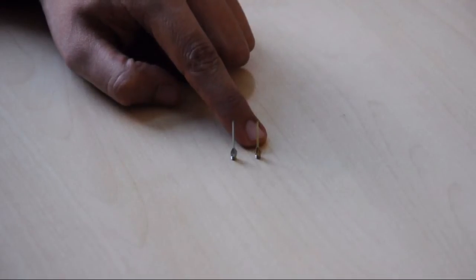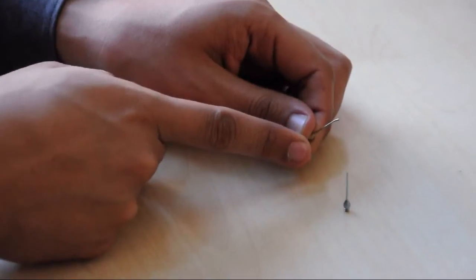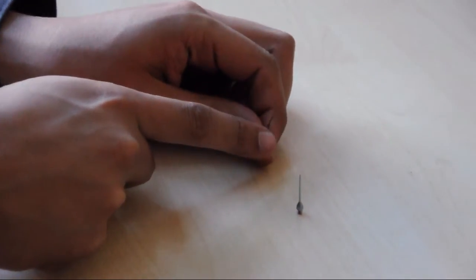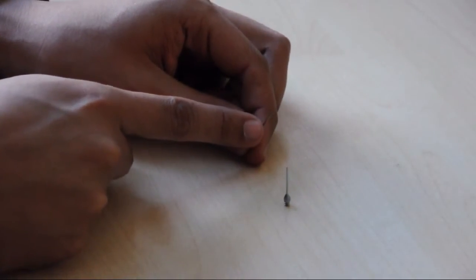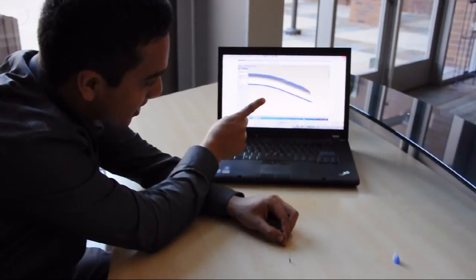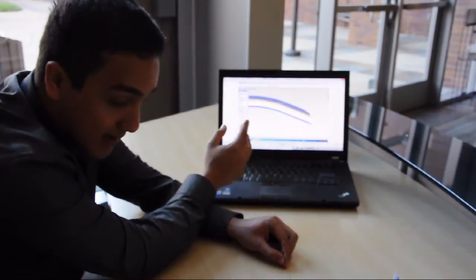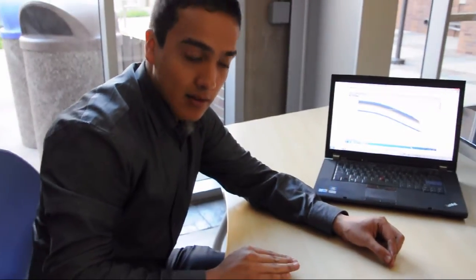This is a modified phacoemulsification tip. This type of tip is named a Kelman tip and has a 30-degree bevel. Upon analysis of this tip's efficiency, we designed a prototype — which can be seen in this Solaris image — that tapers the outer edges into the inner edge. The idea behind this design is that the phacoemulsification tip will have an easier time penetrating the cataract and therefore cutting through it.